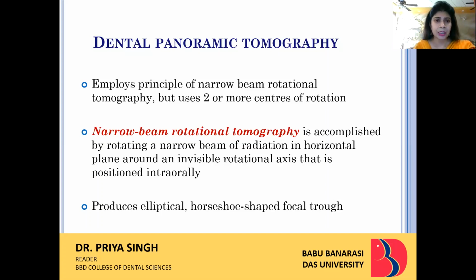Dental panoramic tomography employs the principle of narrow beam rotational tomography, but it uses two or more centers of rotation. Narrow beam rotational tomography is accomplished by rotating a narrow beam of radiation in the horizontal plane around an invisible rotational axis that is positioned intraoral.